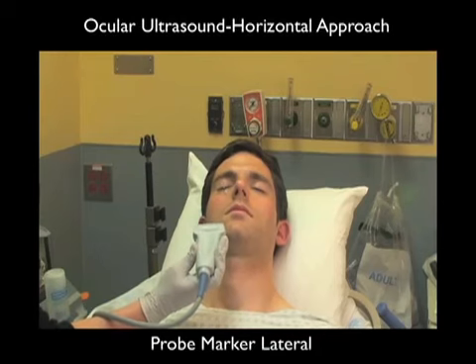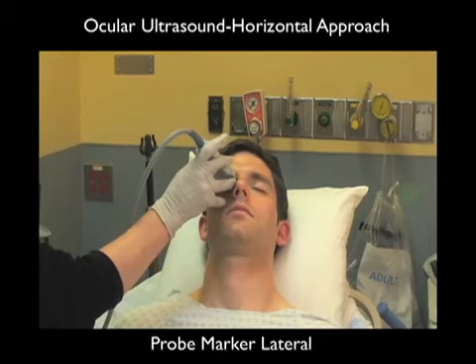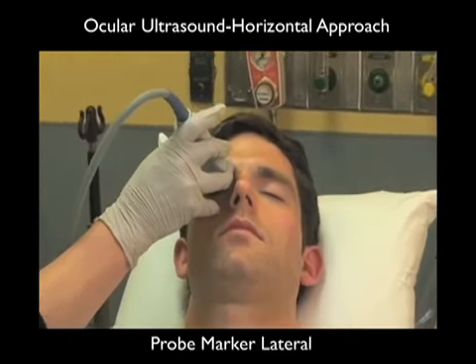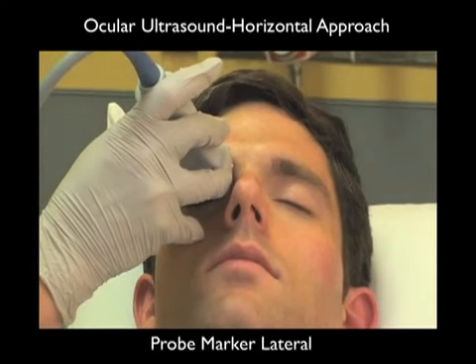Now let's take a look at that same ocular ultrasound approach from a more anterior position. Note again that we're placing the probe, the high-frequency linear type array probe, over the closed eyelid in a side-to-side orientation. Now, the probe marker is going to be oriented laterally towards the outer part of the patient's face. Now remember that if there's any question of trauma or globe rupture, we have to be extremely careful when applying the probe onto the eyelid. In fact, we should really be scanning through a copious amount of gel, known as a gel pillow, and really not applying any pressure down to the actual eye.